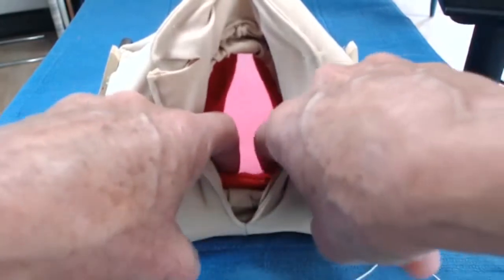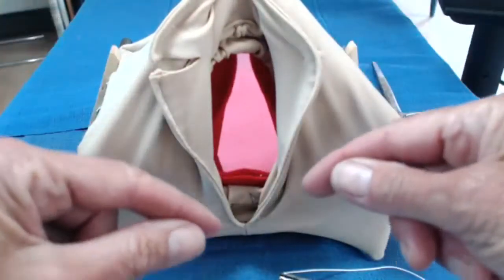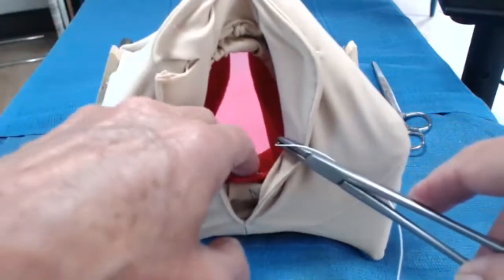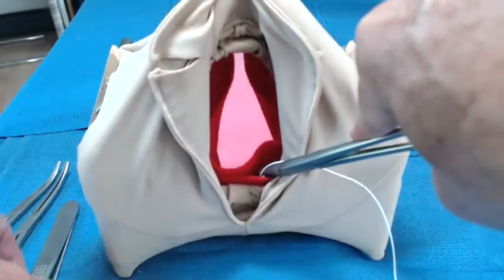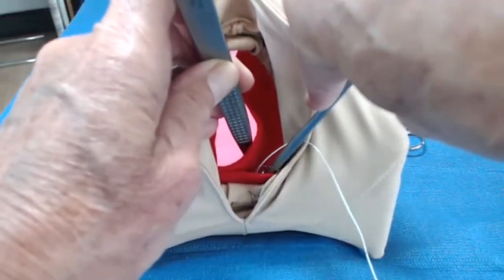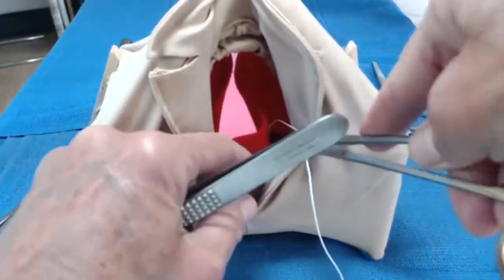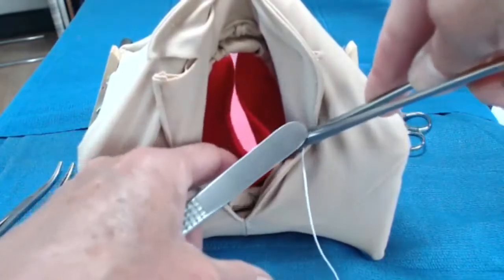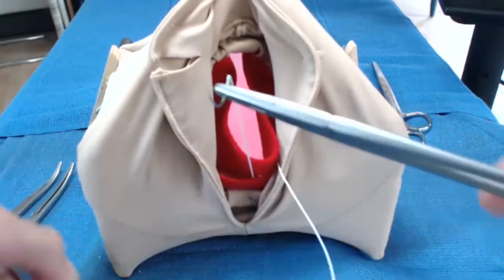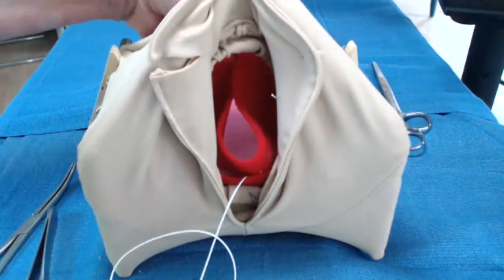We may need to place a figure-of-eight stitch on the side, and this is typically stitched in a couple of layers — going down deep. I'm going to use tissue forceps so you will have better visibility. I'm going to go down deep and take a stitch in the bulbocavernosus first and then deep in the transverse perineal muscle, and pull that up. I would have already placed my stitch, so I'm just going to tuck this out of the way and put a clamp on it so I don't have to stop and tie a knot.